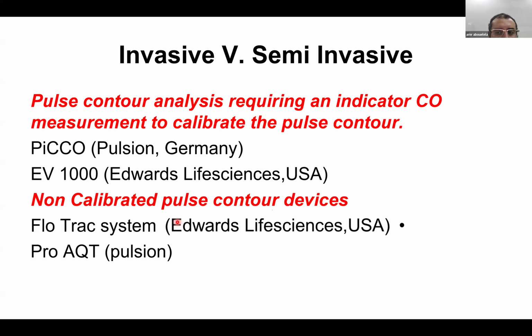We mention it as calibrated because here we are using two technologies at the same time, the thermodilution and pulse contour analysis. If you are not using the thermodilution, you will have the non-calibrated, what we like to call semi-invasive, non-calibrated pulse contour. It depends only on analyzing the arterial waveform by a catheter. And again, there are two different systems. For Edwards, we have the FloTrac system, and for Pulsion, we have the ProAQT. This is the same technology, the FloTrac and the ProAQT.